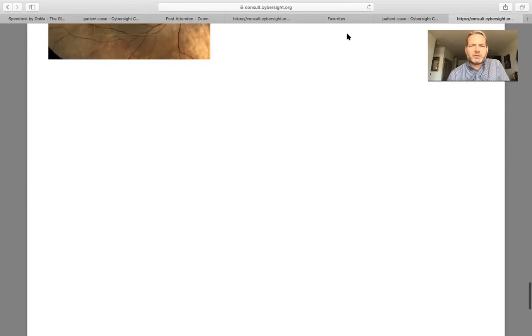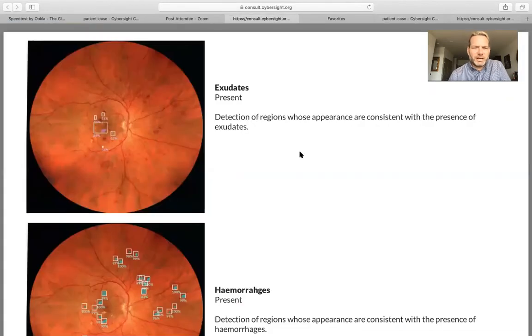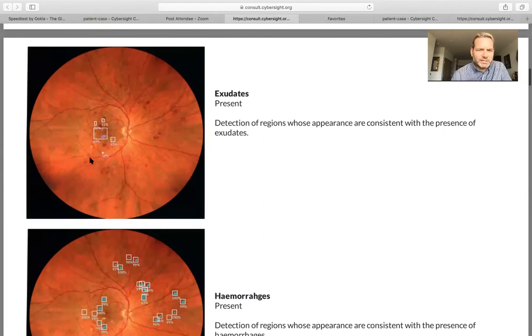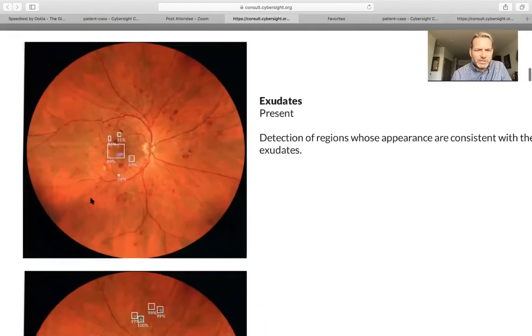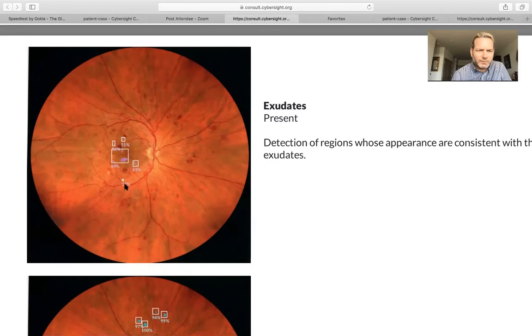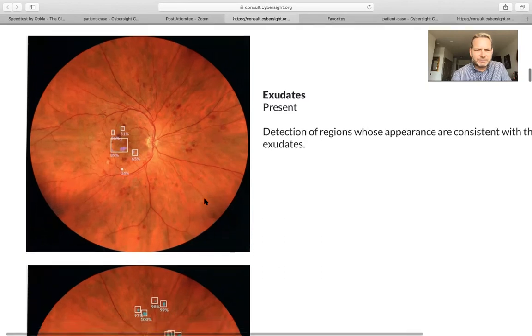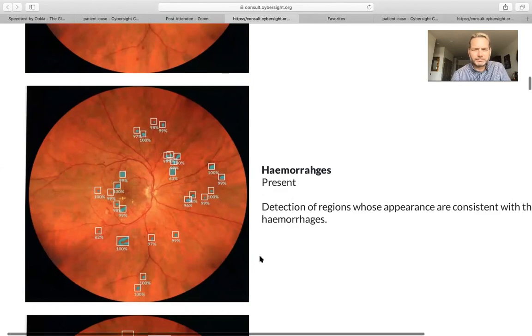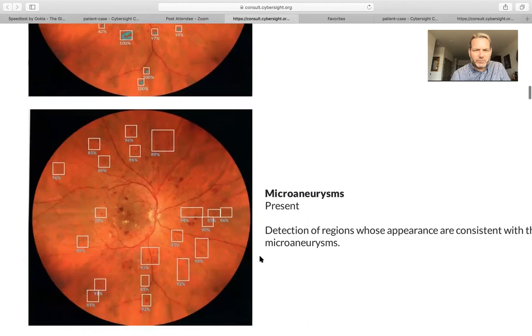I have another case with more significant diabetic retinopathy to show you. Here we can clearly see blot dot hemorrhages on this particular patient, and the exudates are being analyzed by the AI software and highlighted in each of the macular areas. The hemorrhages are much more numerous, and you can see them all being cataloged and highlighted, as are the microaneurysms.